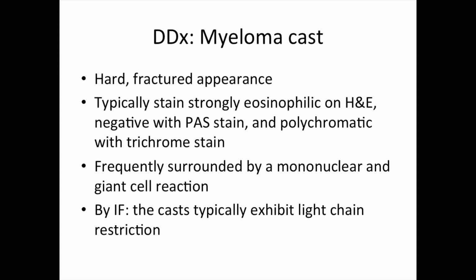So there will be restriction of the light chain and يعني will be significant. يعني واحدة intensity of 1 والثانية intensity of 3، أو واحدة completely dark it is 0 والثاني 4 هاللون يعني.